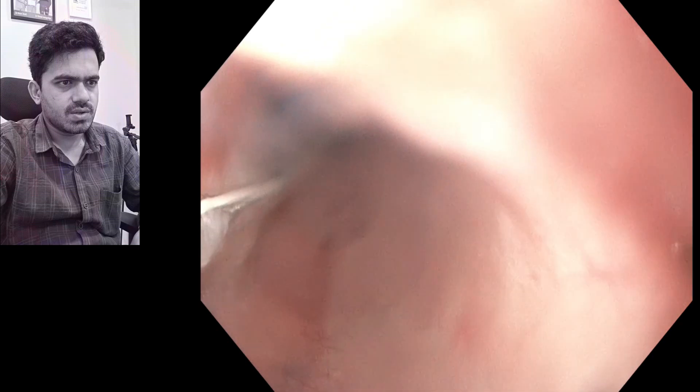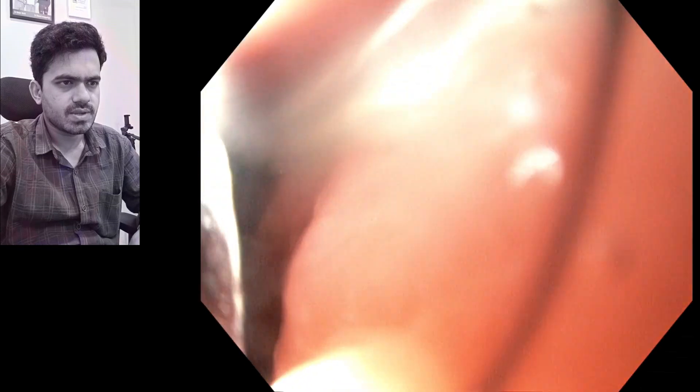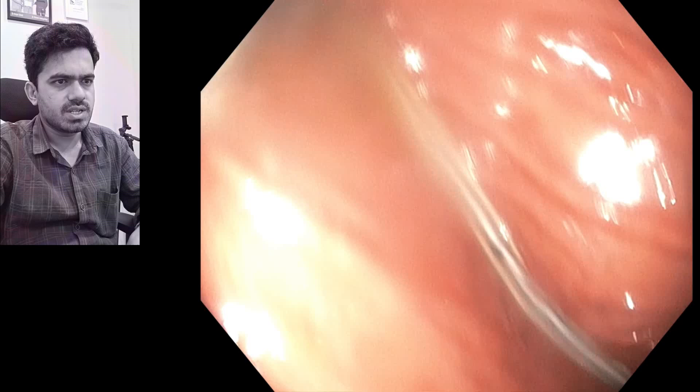Mild sedation has been given to the patient. Now we have entered into the esophagus and are checking the position of the tube. Here it is lying in the mid-body of the stomach.